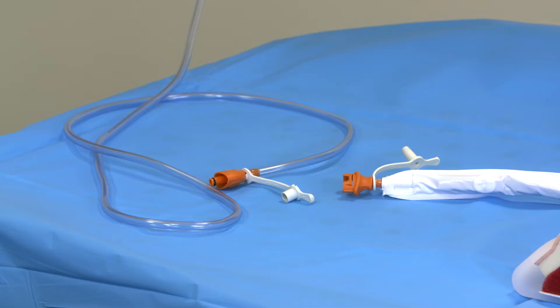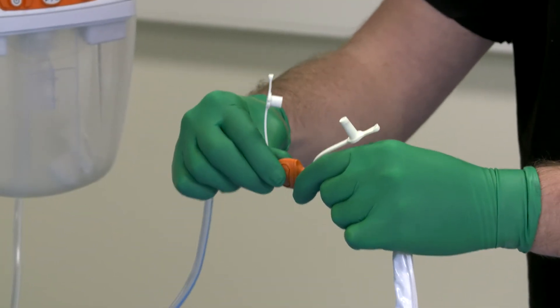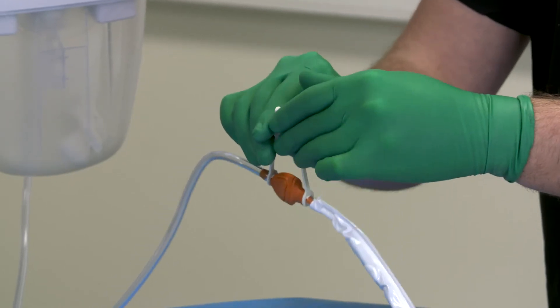Connect the Renesys soft port tubing to the canister tubing by pushing the quick-click connectors together. An audible click indicates the connection is secure.